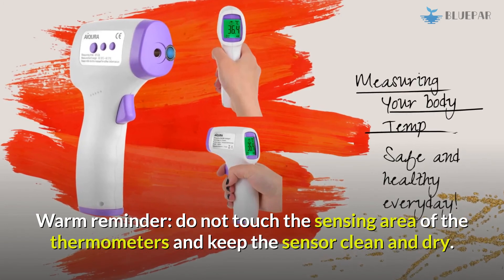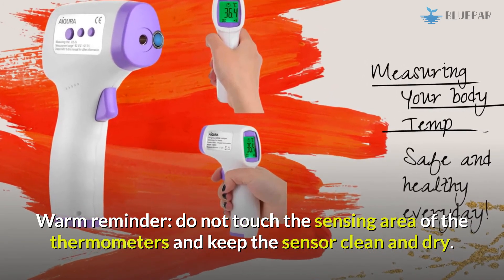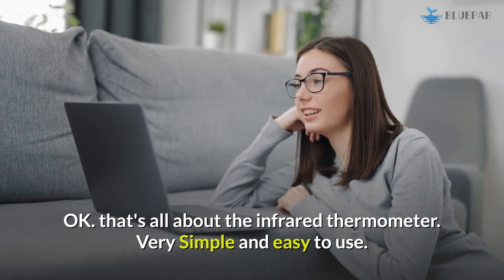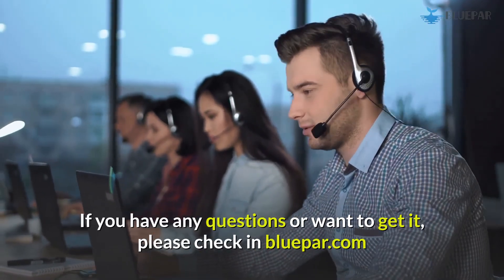A warm reminder: do not touch the sensing area of the thermometer, and keep the sensor clean and dry. That's all about the infrared thermometer — very simple and easy to use. If you have any questions or want to get one, please check bluepar.com.